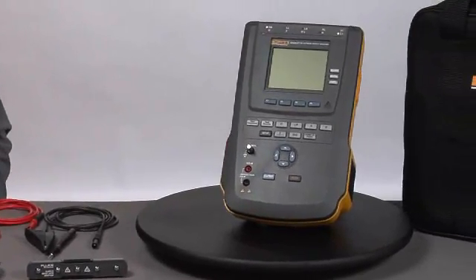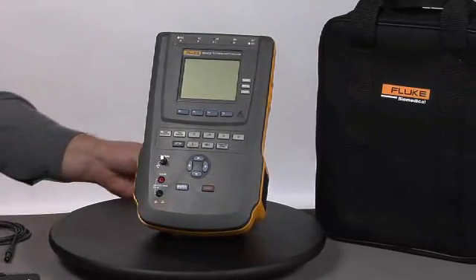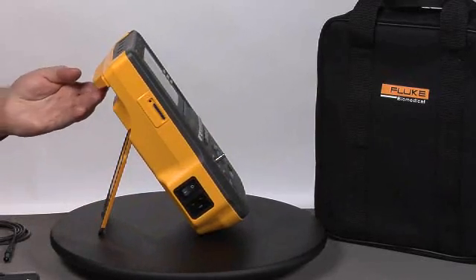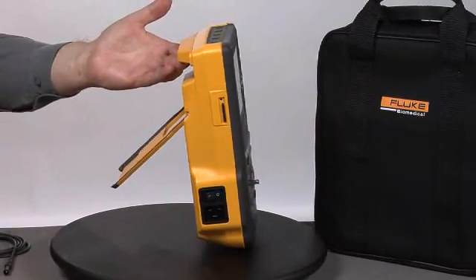Introducing the ESA615 Automated Electrical Safety Analyzer from Fluke Biomedical. This electrical safety analyzer includes a newly designed, very ergonomic carrying handle as well as an easy-to-use tilt stand.